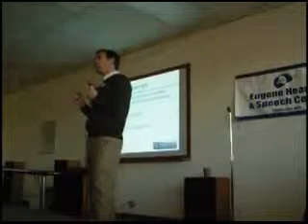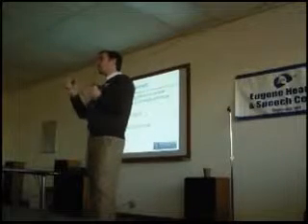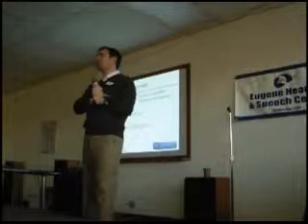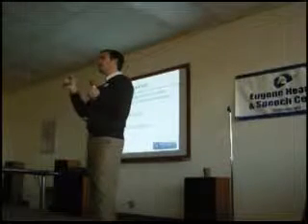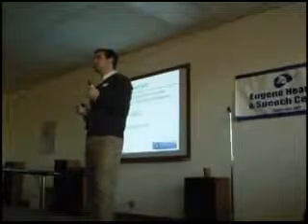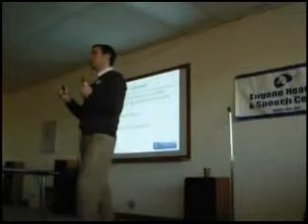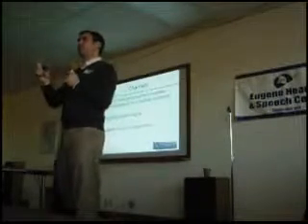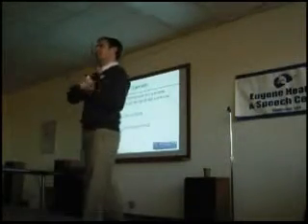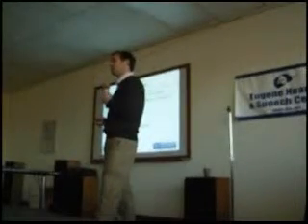A big part for channels, however, is not so much what you get out of it, it's what your clinician gets out of it, because they have greater control for fine-tuning that hearing aid for your hearing loss. So part of channels may actually be something that is going to benefit you. It benefits you directly, but it benefits you via the clinician who's programming the hearing aid.